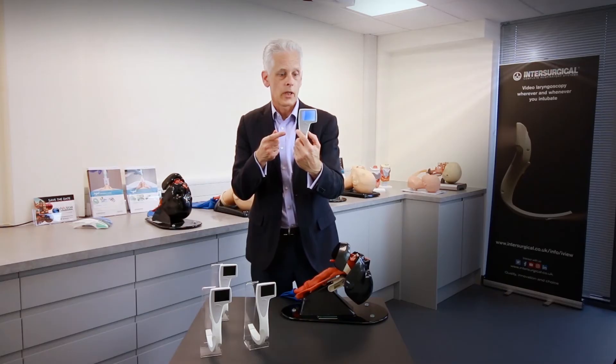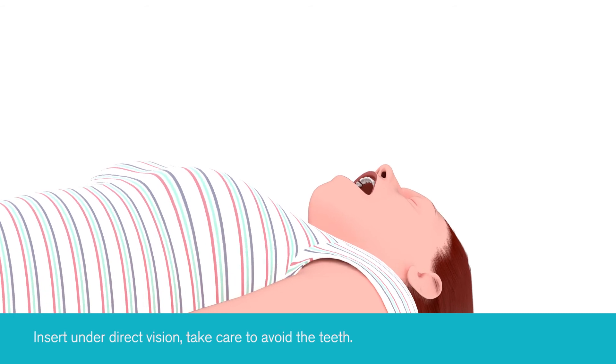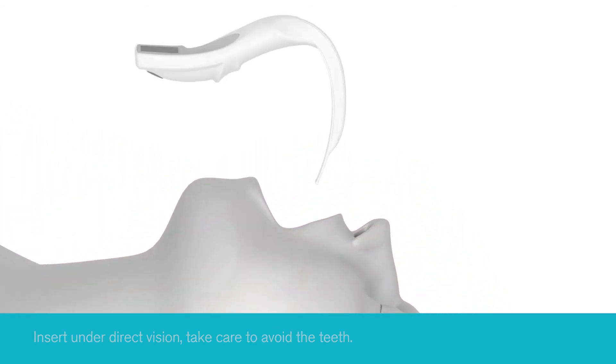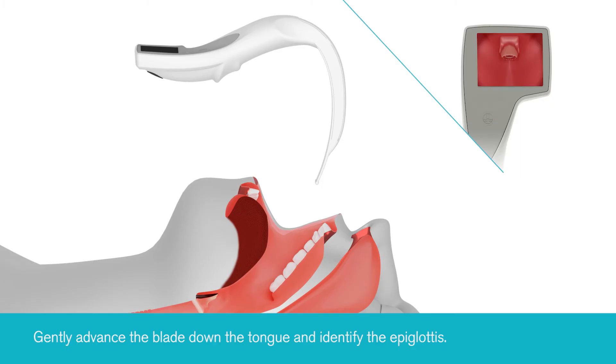I'm now going to show you how to insert the device itself. The distal tip of the blade should be inserted into the patient's mouth under direct vision, and the blade gently advanced down the tongue until the epiglottis has been identified.